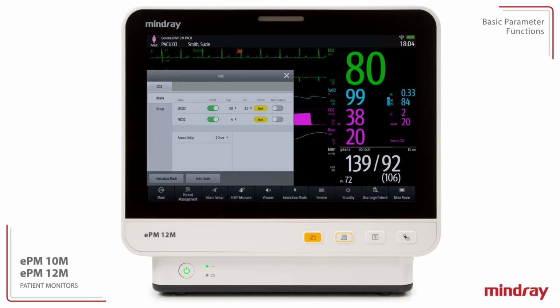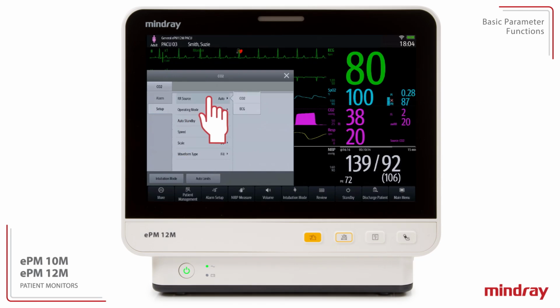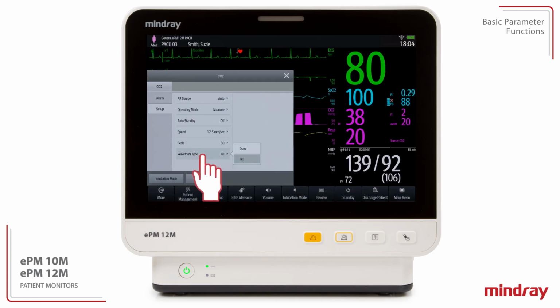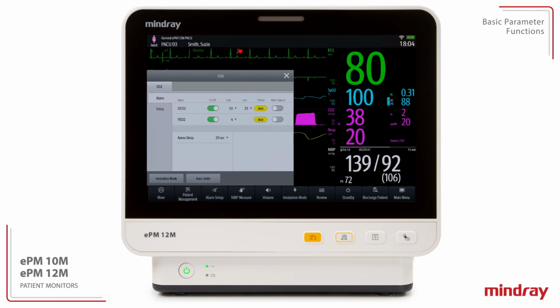The clinician can adjust the respiratory rate source, operating mode, sweep speed, scale, and waveform type, as well as review and adjust alarms for inspired and exhaled CO2.